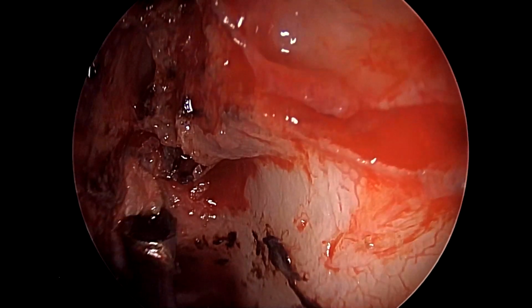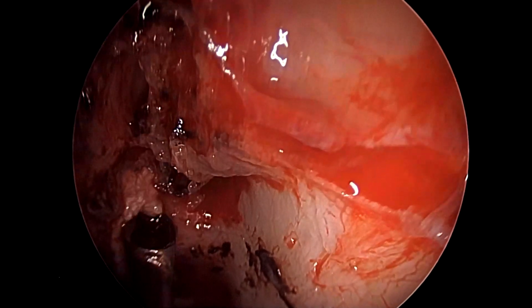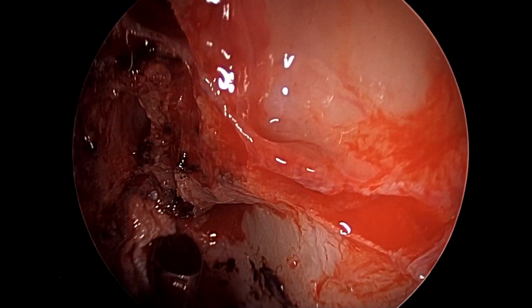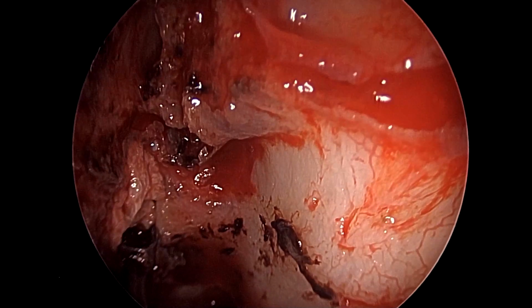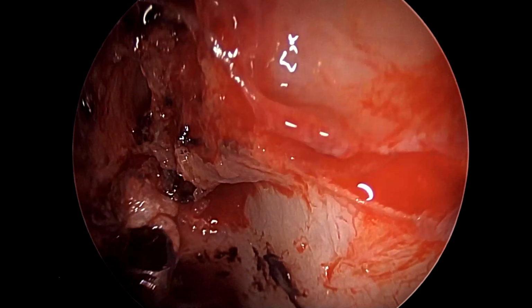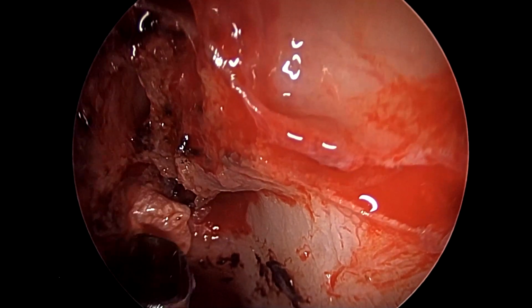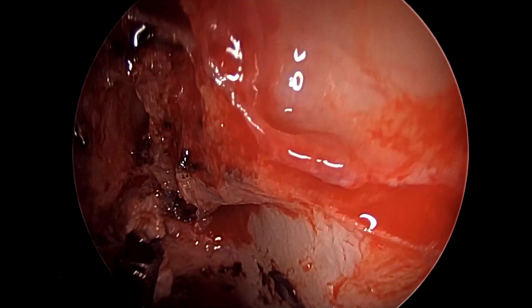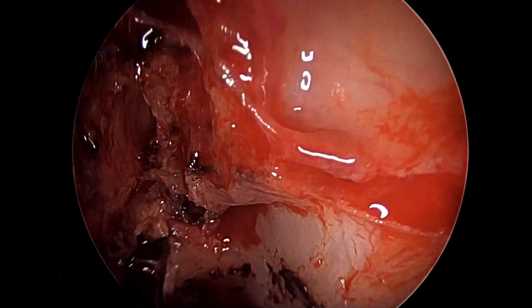As we can see here, we are attempting to use a frontal sinus curette, but this does not appear to be the best instrument for this part because of its bulky size. It is best to use elevators, either skull-base elevators or curved elevators for this purpose.